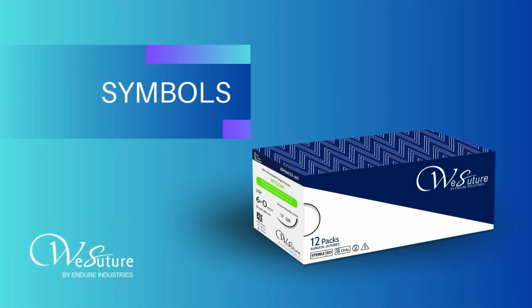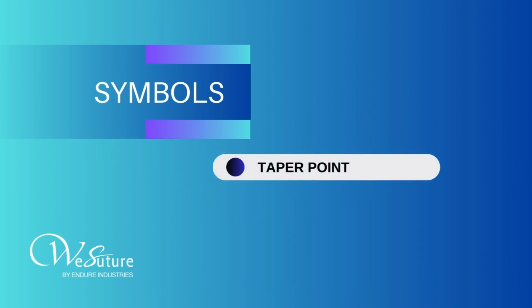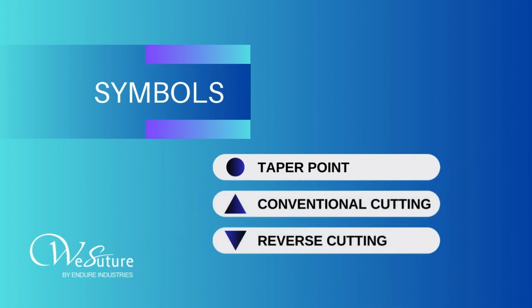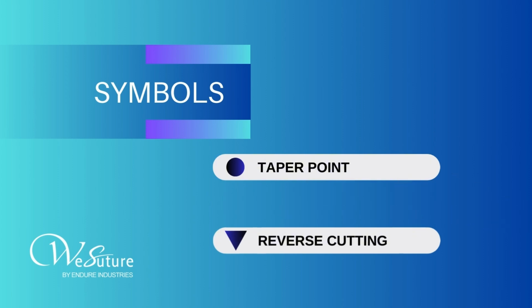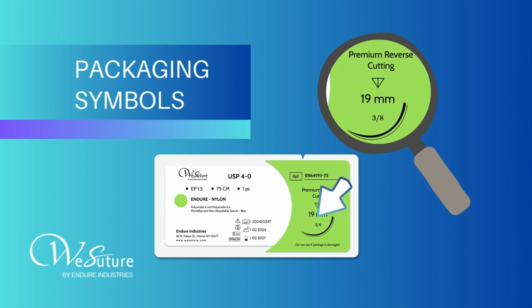When selecting a suture needle, the packaging provides key information. A circular symbol indicates a tapered needle. Two triangular symbols represent cutting needles. Conventional cutting needles have the triangle apex pointing upward. Reverse cutting needles have the triangle apex pointing downward. For example, if we examine the label of this suture pack, we can see a 19 millimeter needle with a 3/8 circle shape and a reverse cutting needle symbol, which, as we discussed, has the triangle pointing downward.